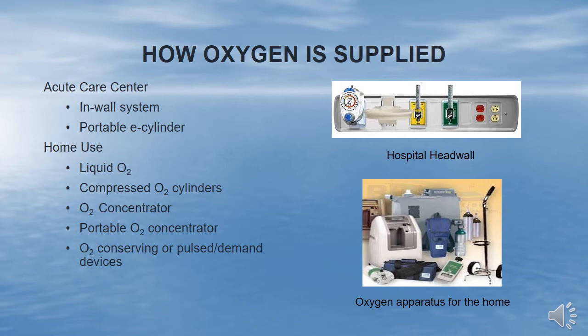It may be in the form of liquid oxygen, which is easier to store, less expensive, and uses no electricity. It does evaporate continually and must be replaced more often than other methods. Oxygen compressed in cylinders is an option, but is more difficult to store, can be more dangerous, and is costly. An electrical oxygen concentrator or extractor is a method that removes nitrogen from room air and does not require refilling. For those dependent on oxygen, a backup plan for electrical outage is necessary.